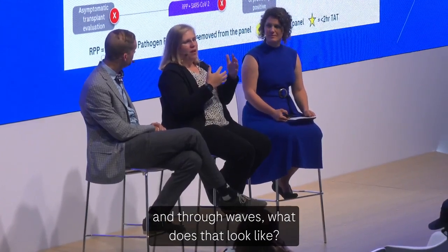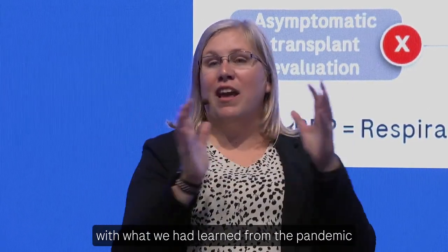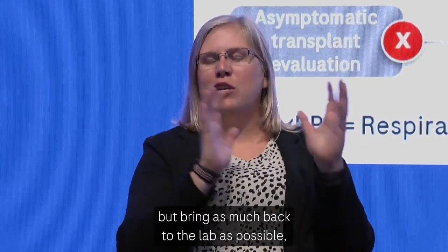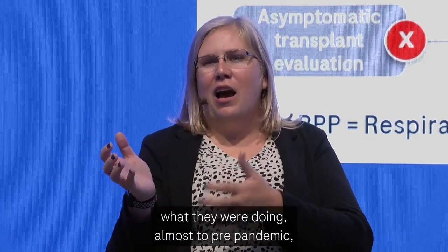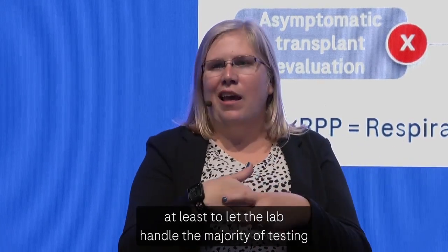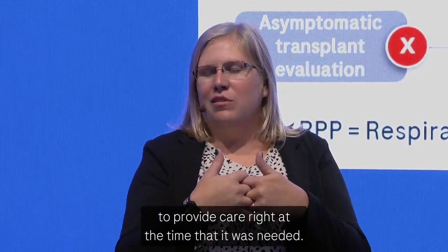And through waves, what does that look like, and then really reinventing the current state workflow to match what we had learned from the pandemic and where we could support through point of care, but bring as much back to the lab as possible to allow providers and clinicians to get back to what they were doing almost pre-pandemic, to let the lab handle the majority of testing and only use point of care when it was really relevant and helpful in the situation to provide care right at the time that it was needed.